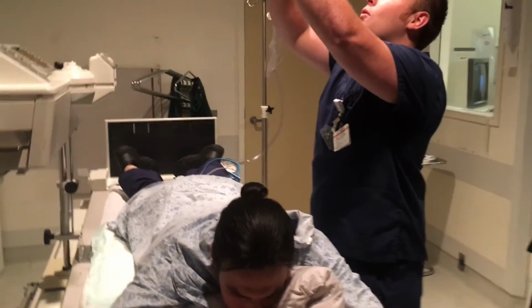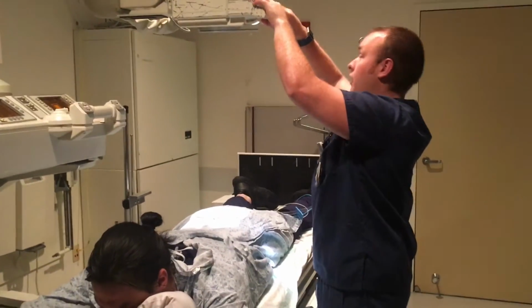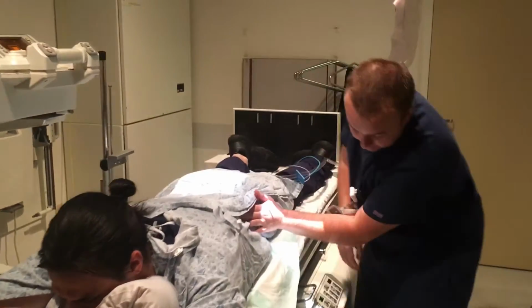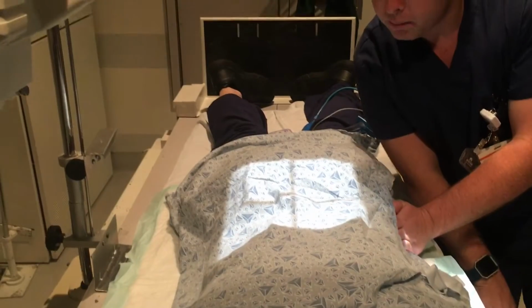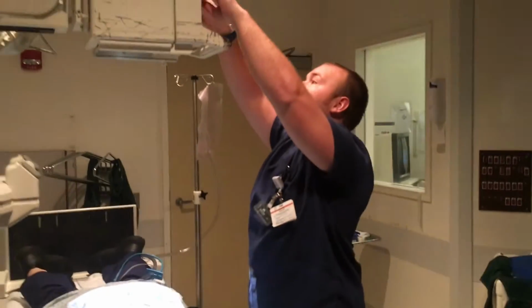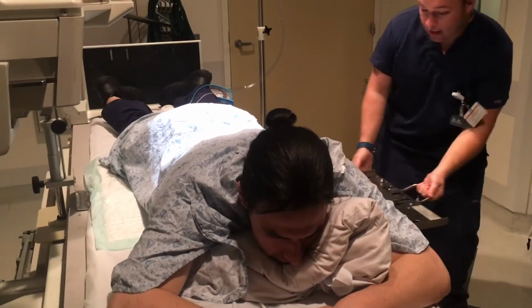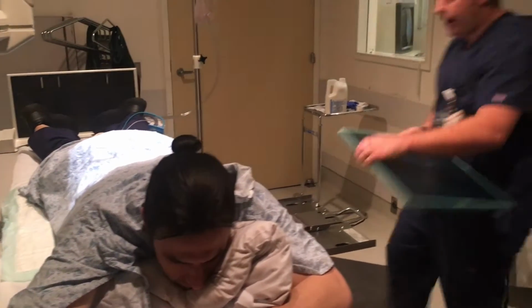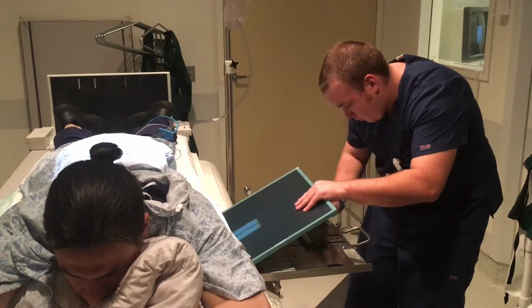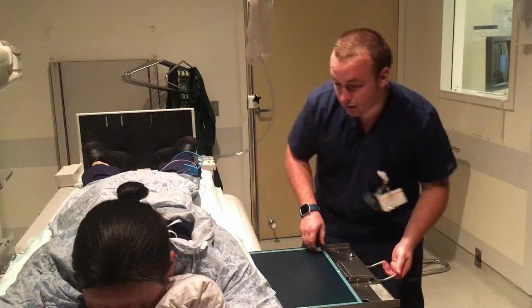Alright, I'm going to do a SID of 40. Central ray and center at a mid-sagittal plane at the iliac crest. So I'm going to go ahead and palpate for the iliac crest, and make sure we get mid-sagittal. Fill the spine. I want to be at a 14 by 17. There we go, and I'm going to get a plate. We're going to go lengthwise. And on the patient's left side, I'm going to flip the marker upside down so it matches anatomically.